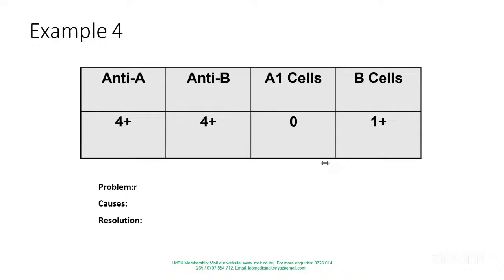You need to respond. Someone got the other one, A2, that was good. Rita Cherono also, I've gotten this one, Rouleaux formation. Any other person?